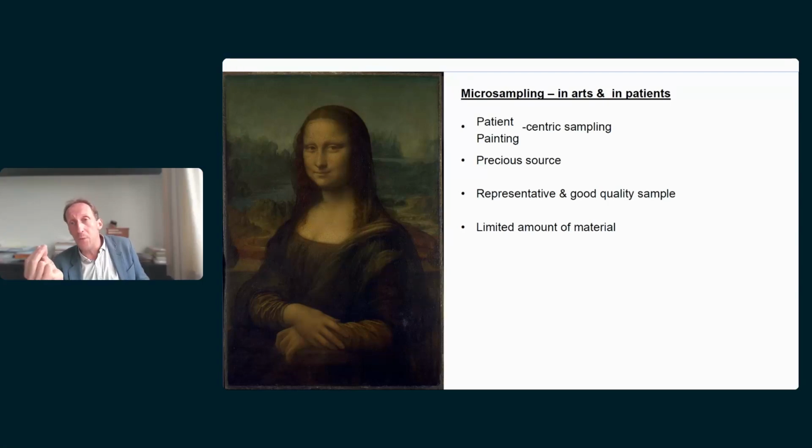Typically, if we proceed with the sample preparation and the injection into a system, we can't collect everything on the one hand. We can't have a recovery of 100%, and we can't inject everything. So it could be that we inject only 1 picogram or even less on the instrument. And obviously, this does pose a challenge in terms of sensitivity.